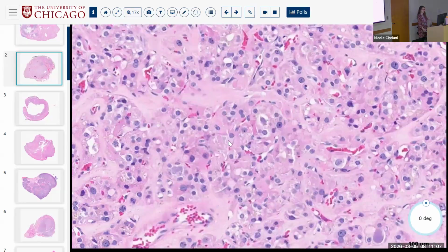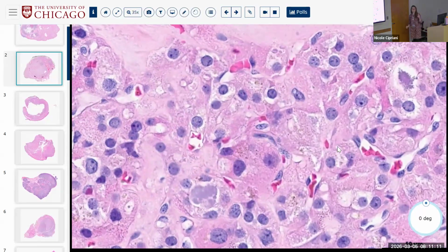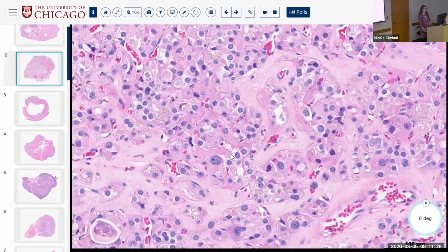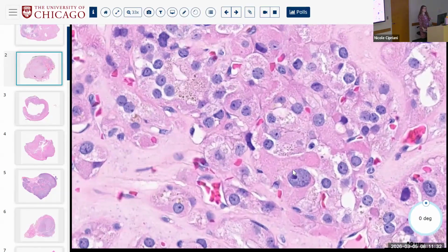Now, what do you see about the morphology of the cells? One word. Salt. Okay, some salt and pepper chromatin. High grade? Why? More big. You can't really call high-grade thyroid cancer on one field. You remember with endocrine organs, you can have random endocrine atypia, where you can have isolated nuclear enlargement. That does not mean anything necessarily bad.